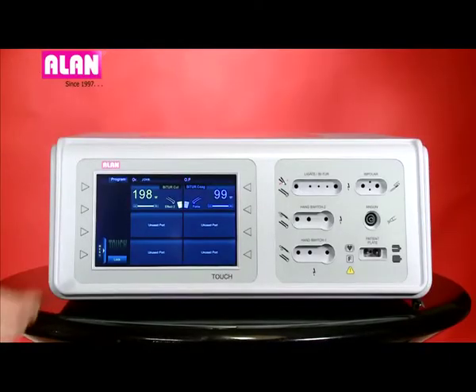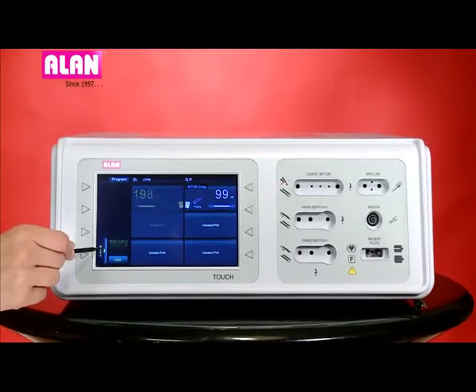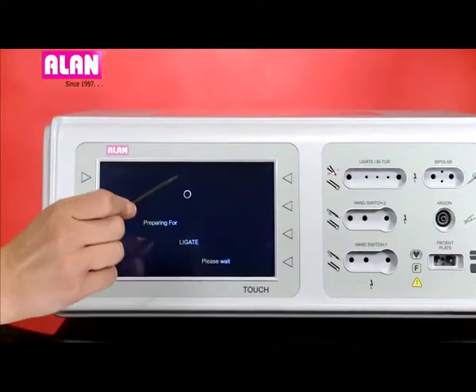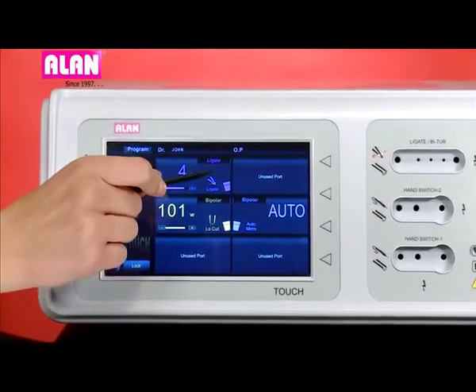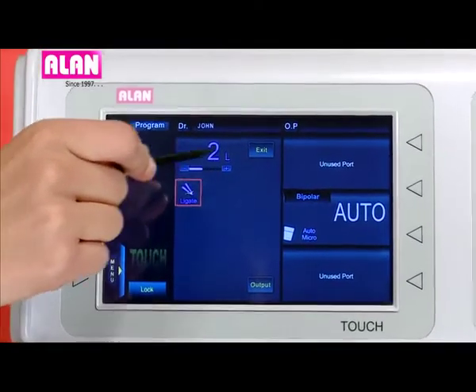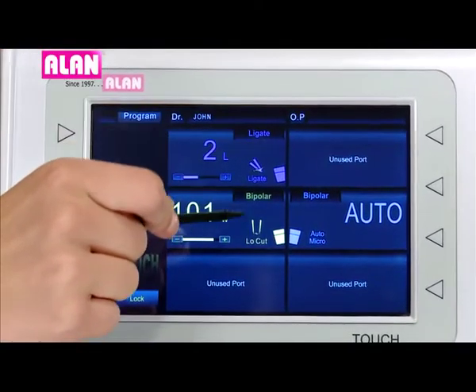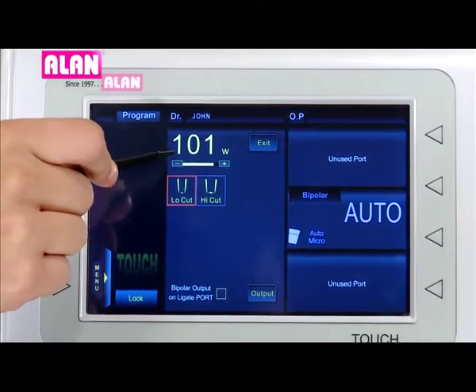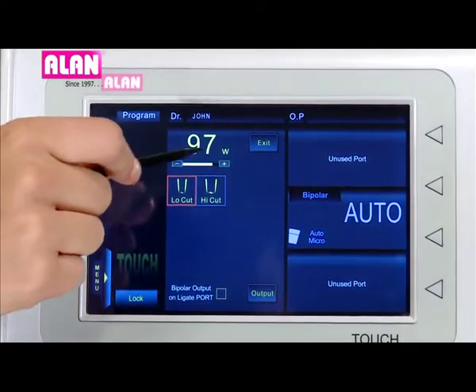User can switch to Ligate mode, touch menu icon and Ligate icon. System will initialize it to Ligate mode. The power levels, foot switch selection and mode selection can be done for Ligate.